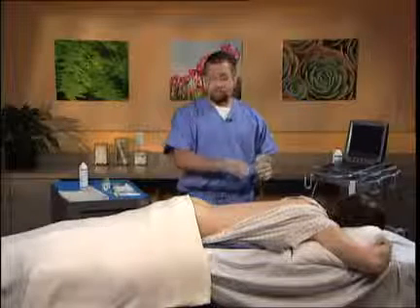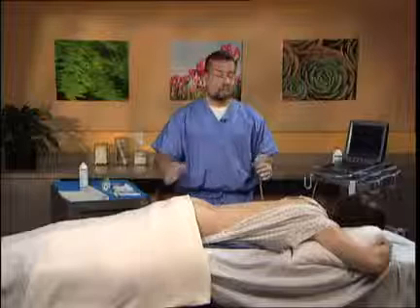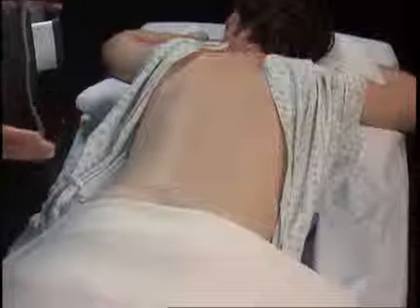In order to facilitate placement of the patient for the procedure, it is necessary to have the patient in the prone position as seen here. This is a typical position that would normally be used for a lumbar epidural steroid approach. One key difference, however, is the need to move the gluteal folds so that access to the sacral hiatus, which is the key target, is facilitated.